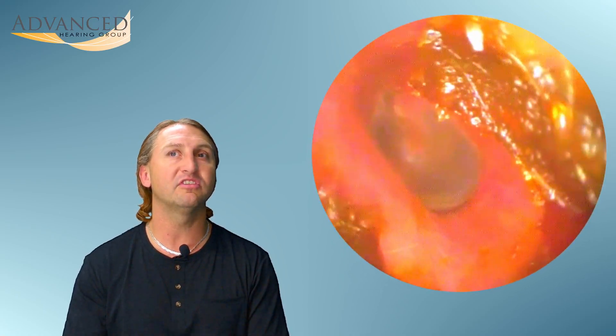You can see that eardrum there, it's looking pretty good. A little bit of redness and irritation, but part of that is definitely the coloration of the earwax rather than actual bleeding in the ear canal. That can cause some bleeding down there if that wax gets stuck to the side of the ear canal wall.